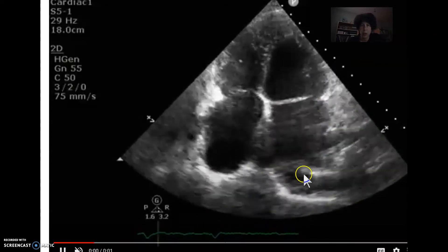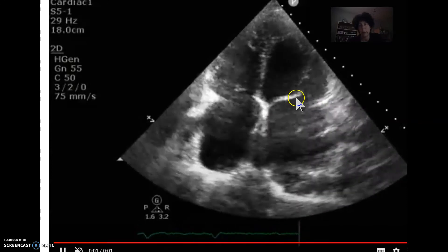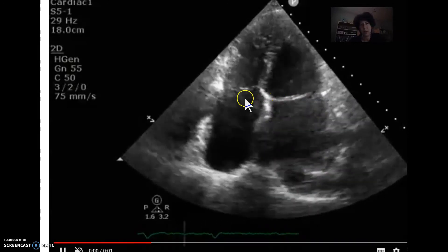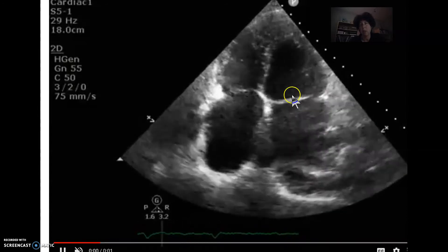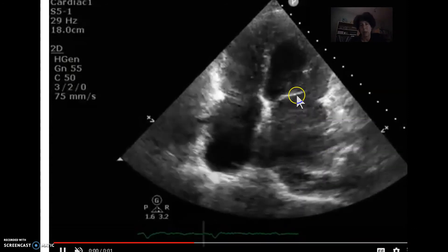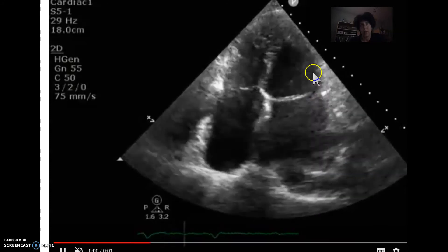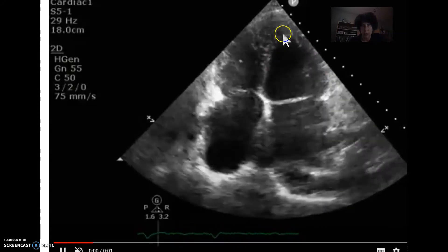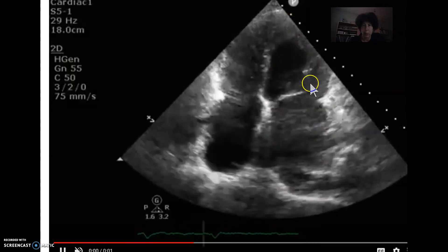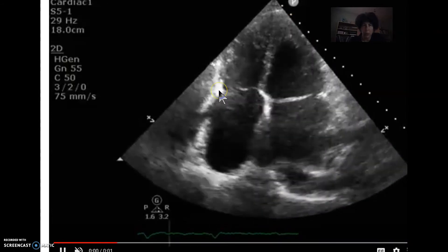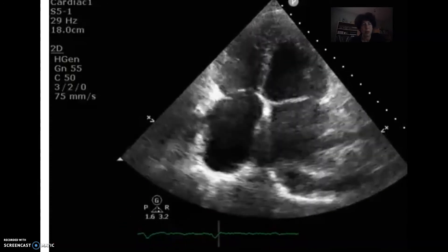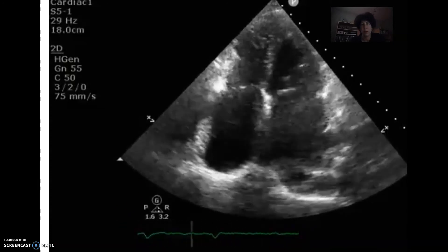The atria are as big or bigger than the ventricles, which represents severe bi-atrial enlargement. The mitral valve is not opening very well — it's a bit bright but certainly doesn't look thickened or what you'd expect from mitral stenosis. Based on the rest of the heart, this probably implies a low flow state. I see thickening in all areas, though fractional shortening looks a bit reduced. Looking at the RV, everything is moving but decreased in function, with very large bi-atrial enlargement confirmed.